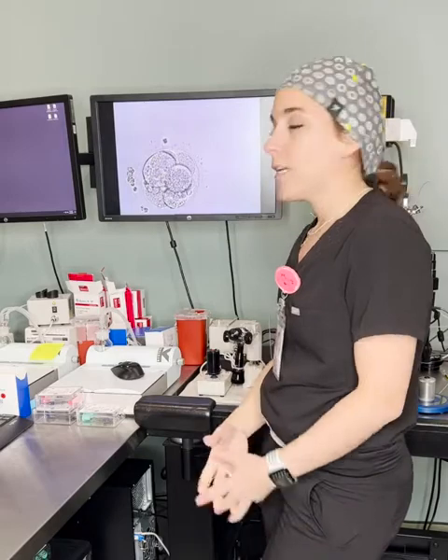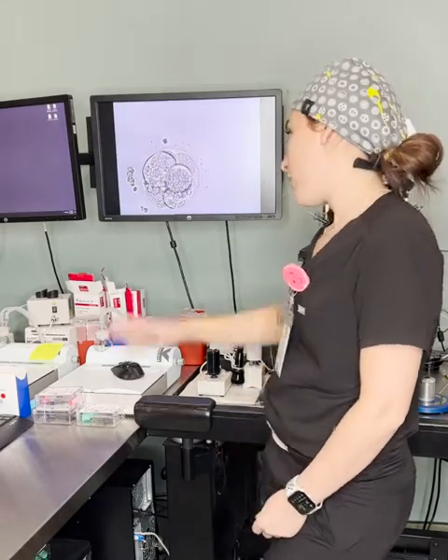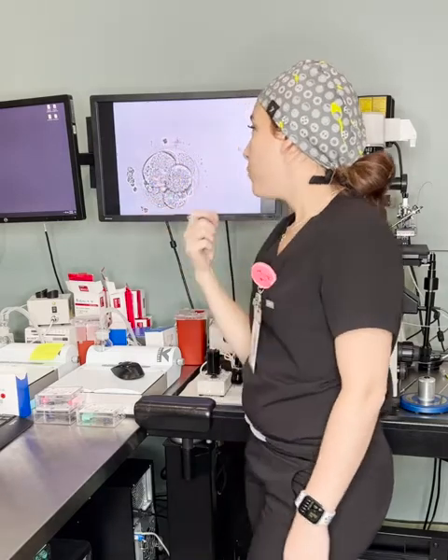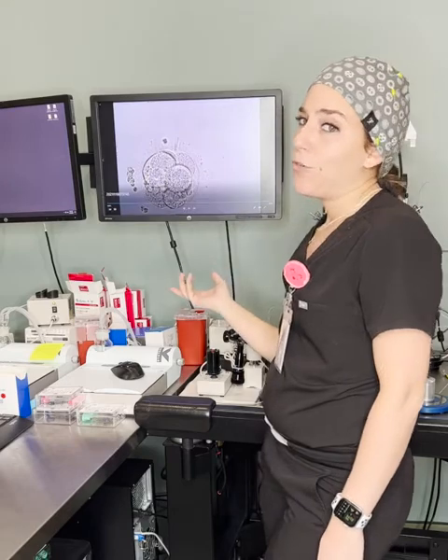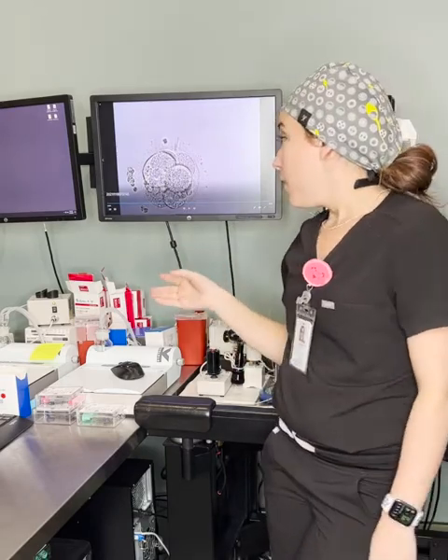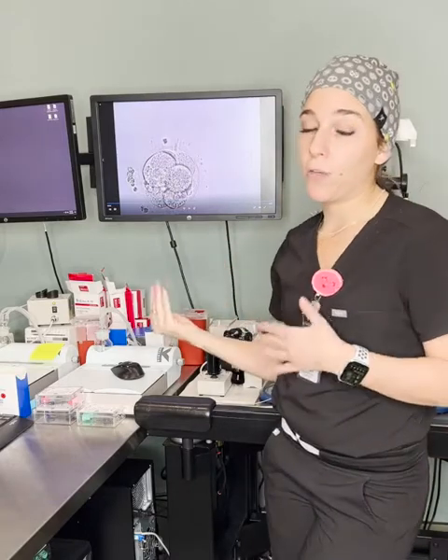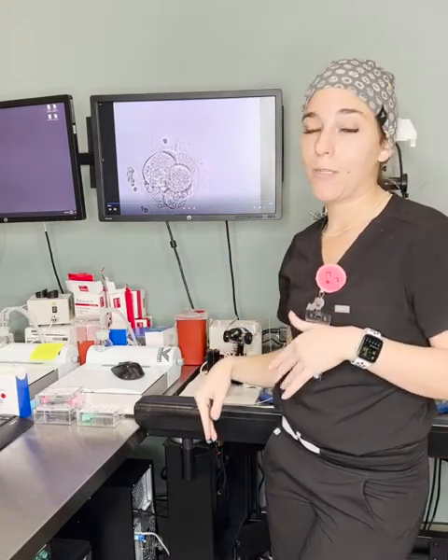Again, this is another day 3 embryo, not as nice as the previous one. As you can see, a bit of fragmentation. I picked this area over here to do my hatch on. Again, it does have over 6 cells. I would give this a grade 2, not a grade 1. The cells are not symmetrical, there's fragmentation. However, this actual embryo did make a blast that we were able to biopsy and came back euploid.